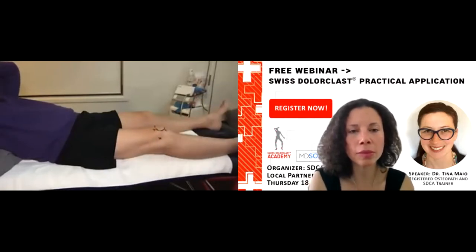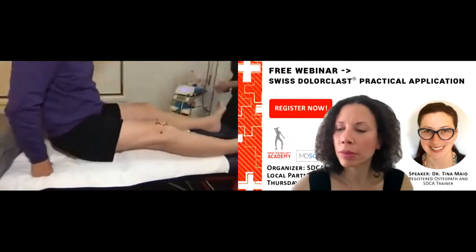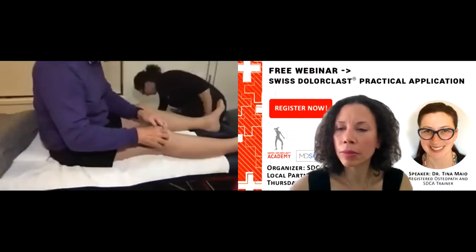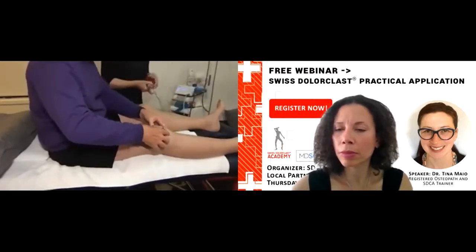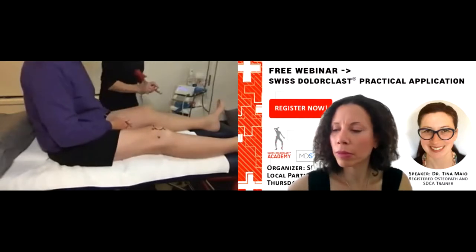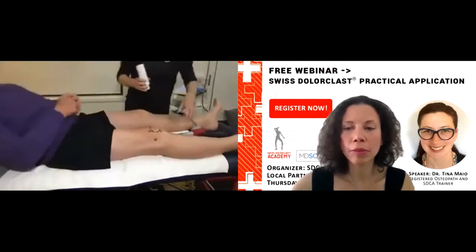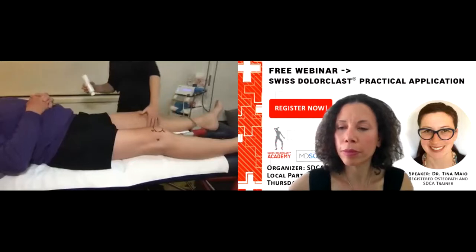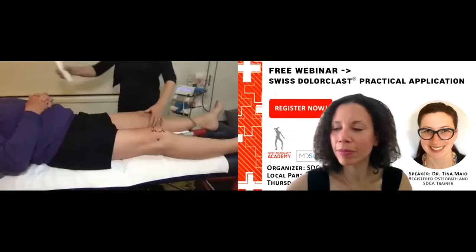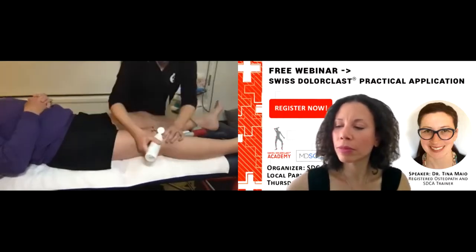Okay, so I'm going to turn this machine on. I'll come around here, so hopefully you can see. And we're going to apply the gel, so you can lie down. Do you want to move down a bit? Are you okay? So your head's on there? Are you sure? Okay. So make sure your patient's comfortable. So we're going to start. I'm actually going to start, so I know there's no movement there, on the joint line first.